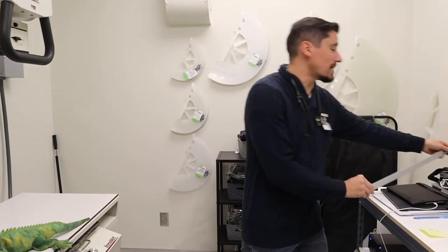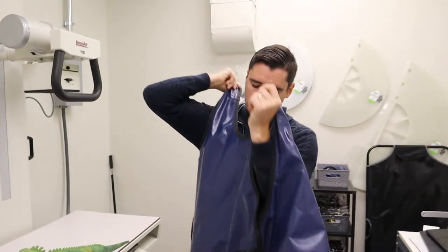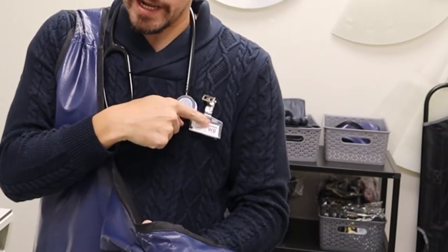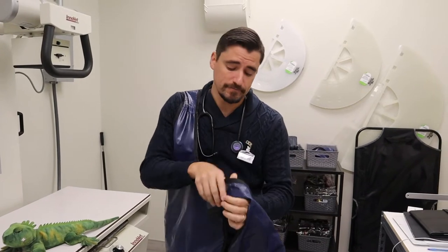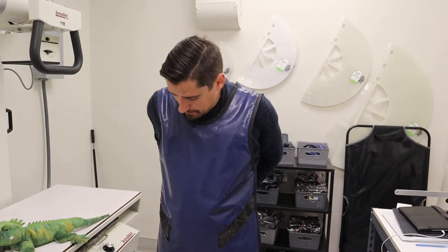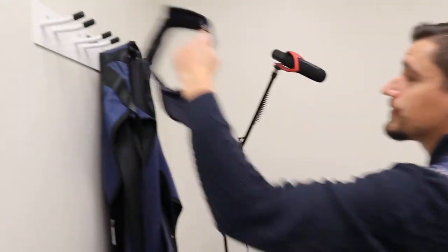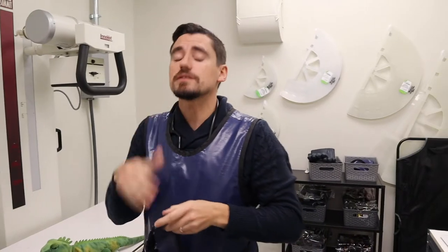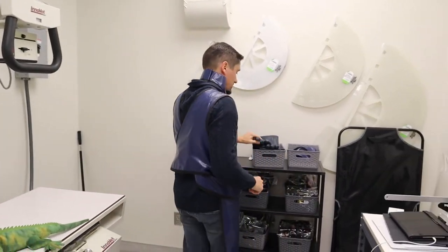So we measured and it looks awesome. Now it's time for me to be safe. I'm going to come over here and grab my gear. I also have a badge on — this allows me to be assessed if I'm over-radiating myself over a certain duration of time. I now have my lead apron on to protect my body, and I'm also going to grab my thyroid shield because that needs to be covered up too. And then let's grab some gloves.